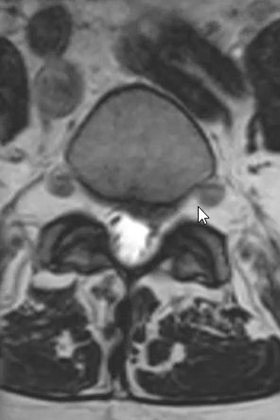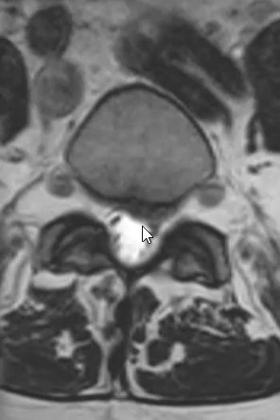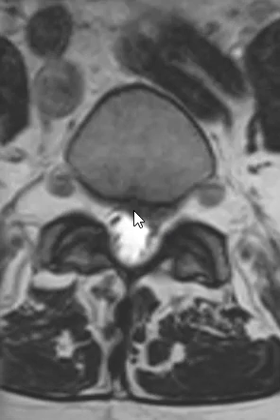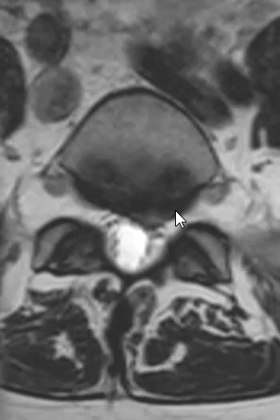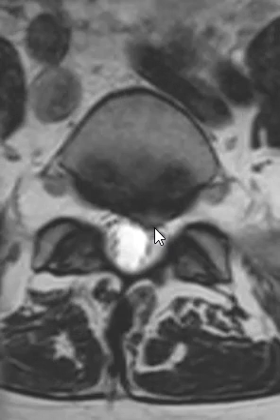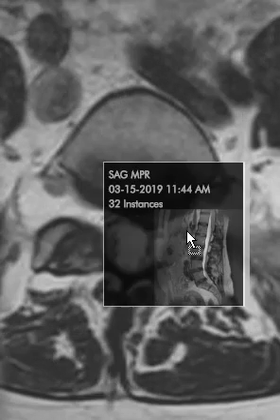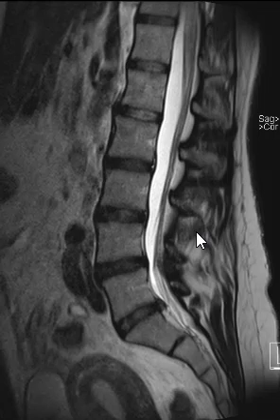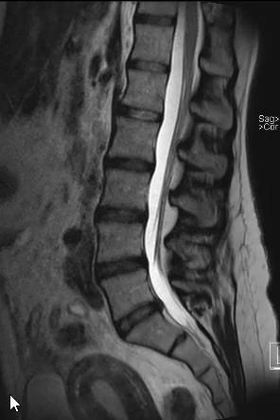At the lowest level, L5-S1, there is a disc protrusion off toward the left, pushing on the left S1 nerve, which would cause left-sided sciatica. That is how we read an MRI of the lumbar spine — hopefully that was interesting, and thank you very much for watching.